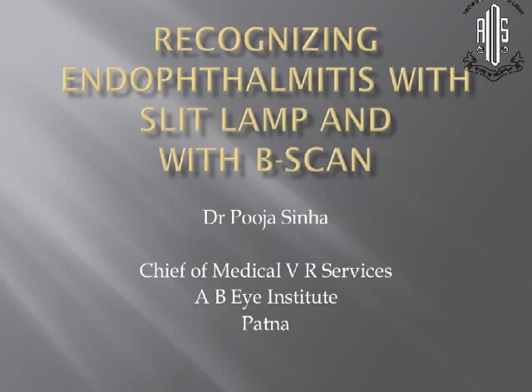I will be speaking on recognizing endophthalmitis with slit lamp and with B-scan, the two basic tools that we have with us.